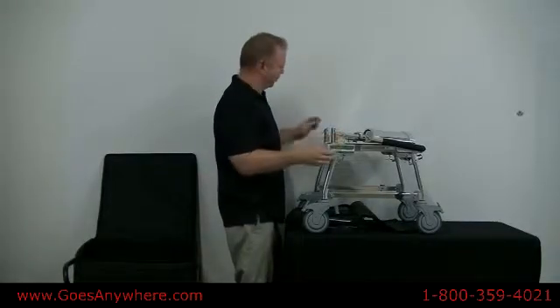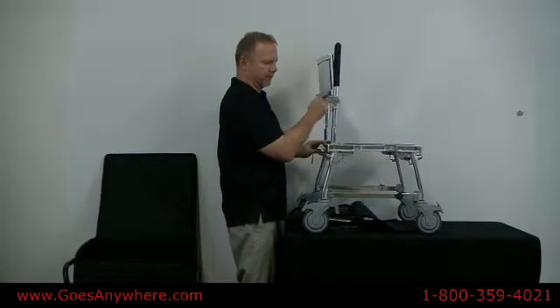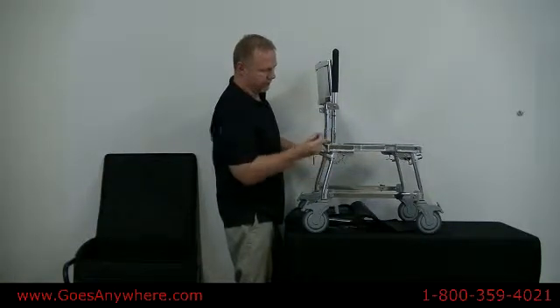Pull out the through pins, lift the backrest, let it fall into its socket, and replace the through pins.